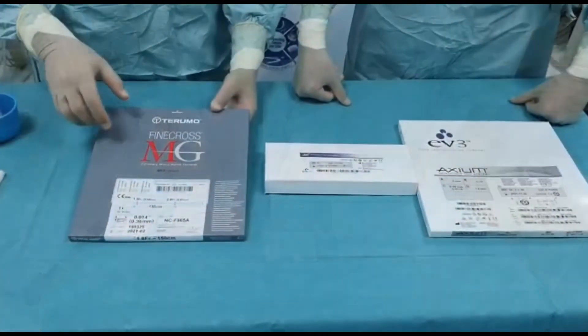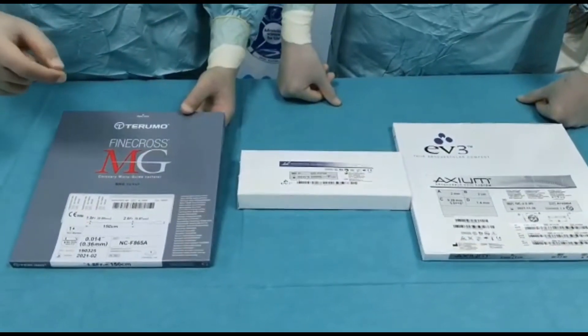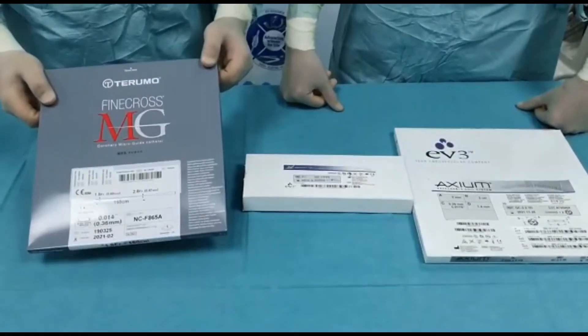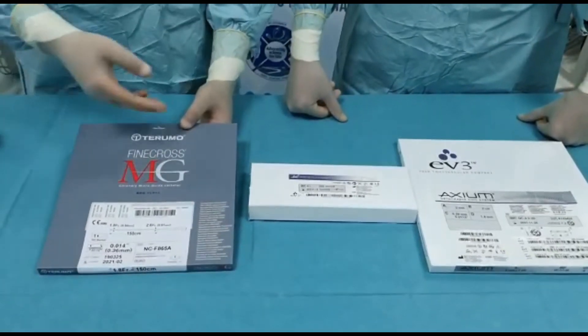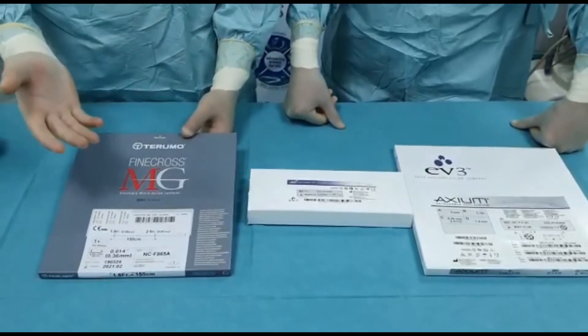The equipment you need for coronary coiling in cases of perforation, especially for epicardial or even septal perforations, is a micro catheter. The usual one is 0.014. An example is the Finecross, but you can also use the Corsair or even the Turnpike — anything 0.014.